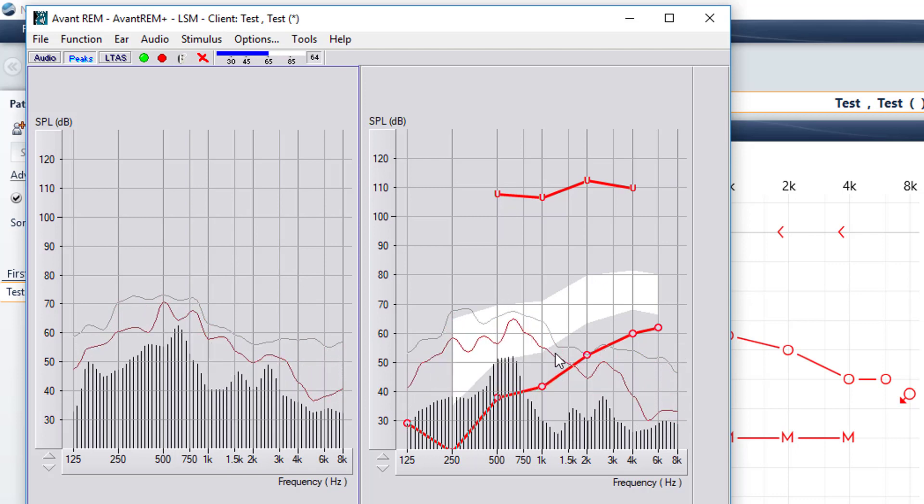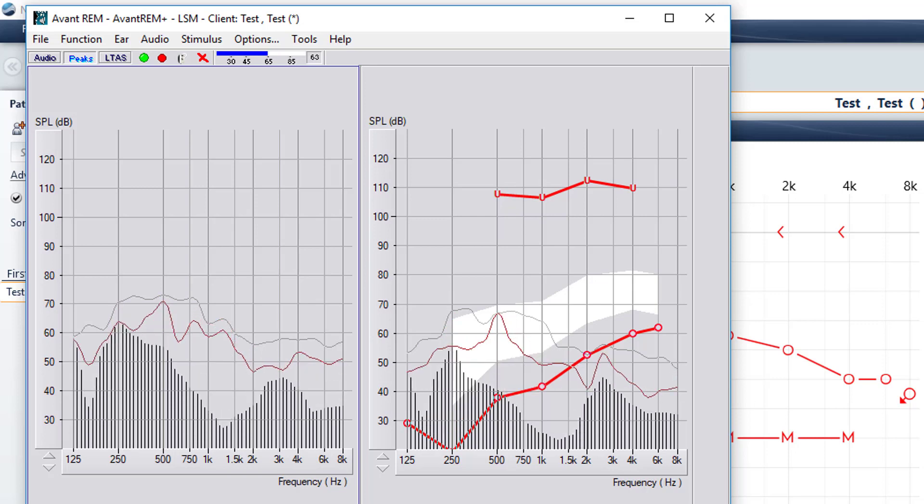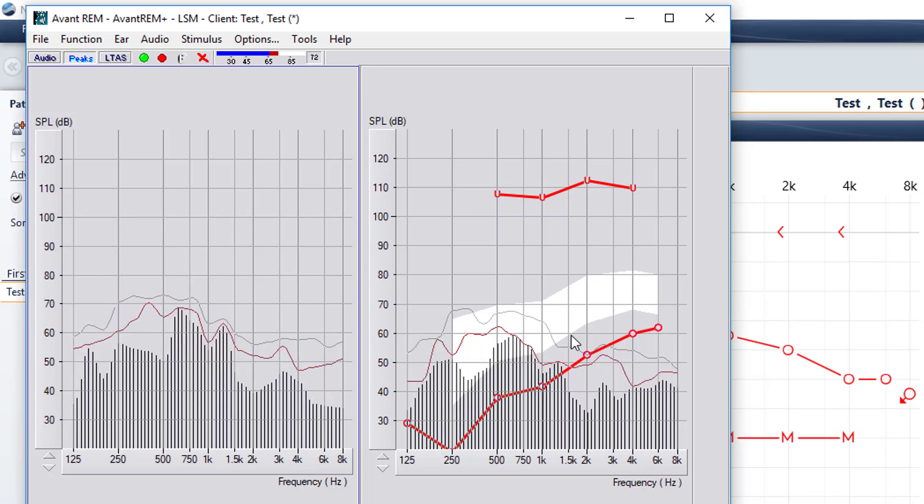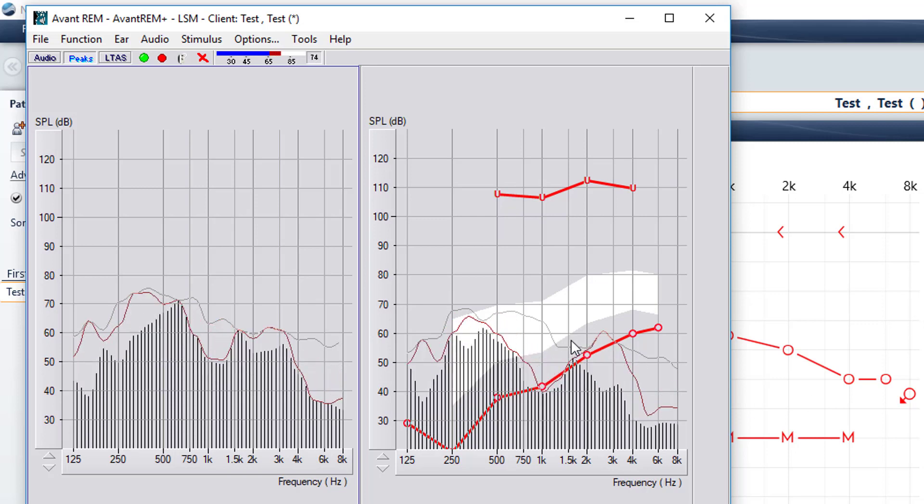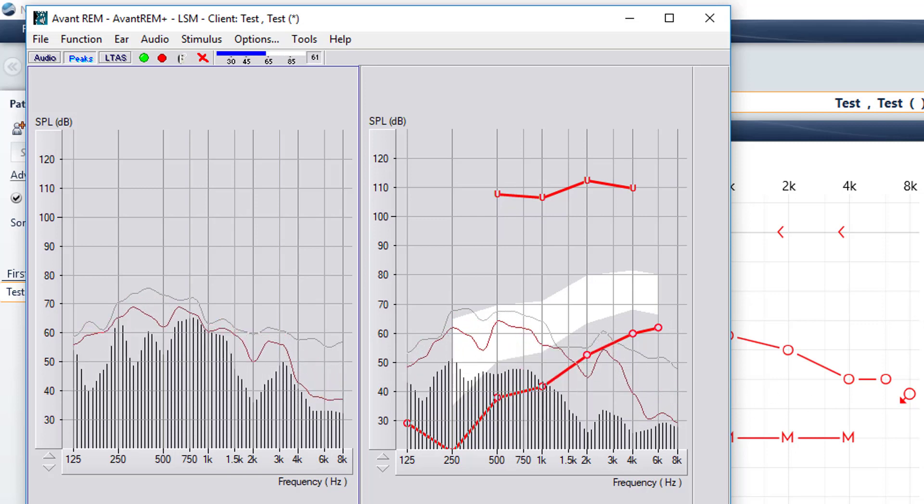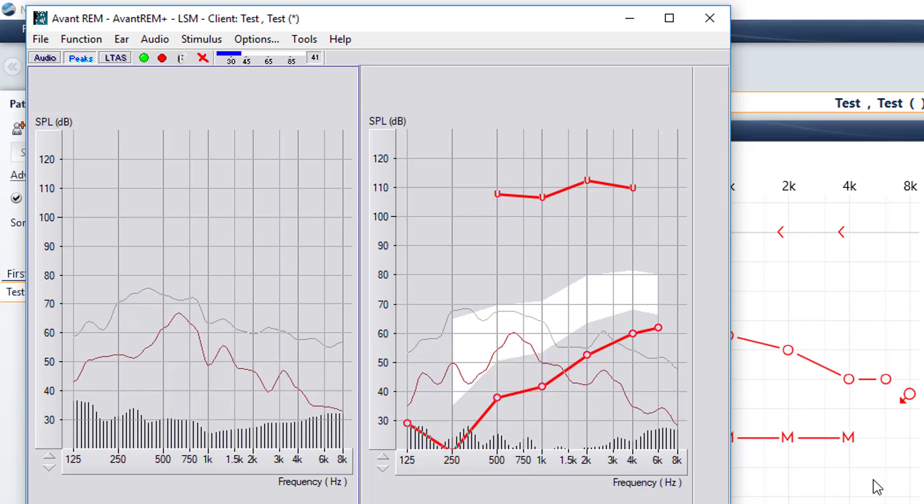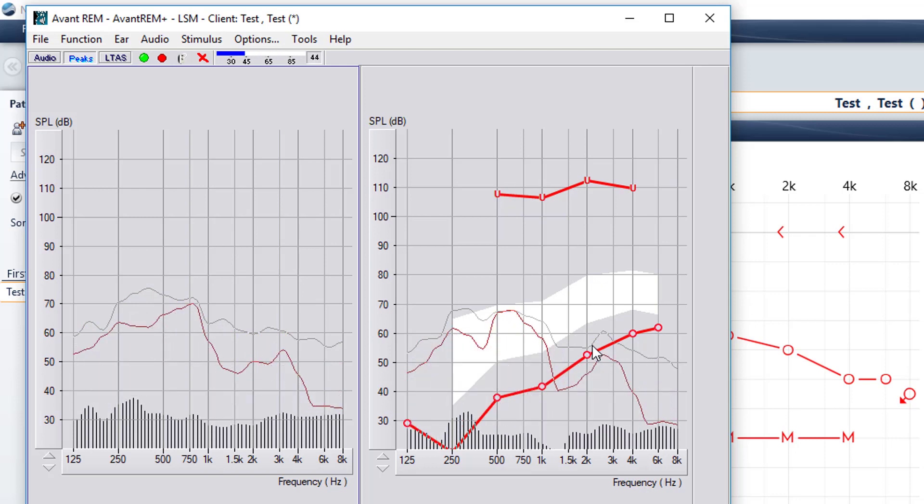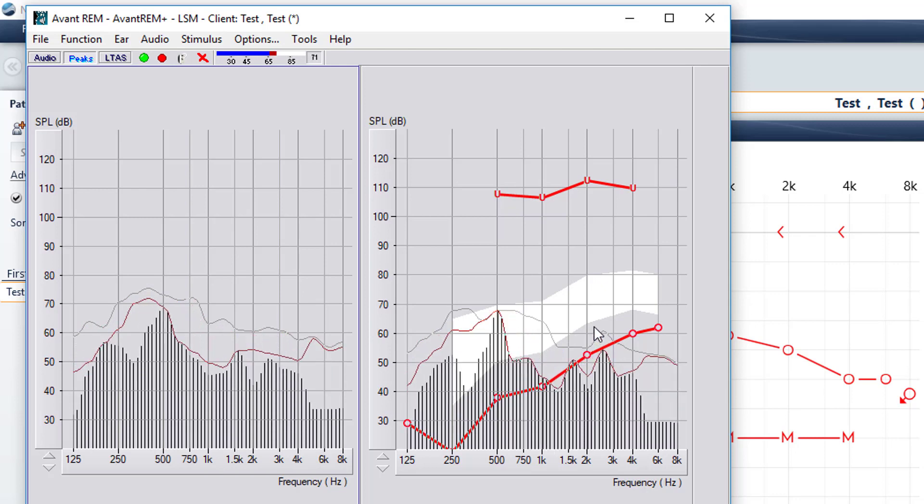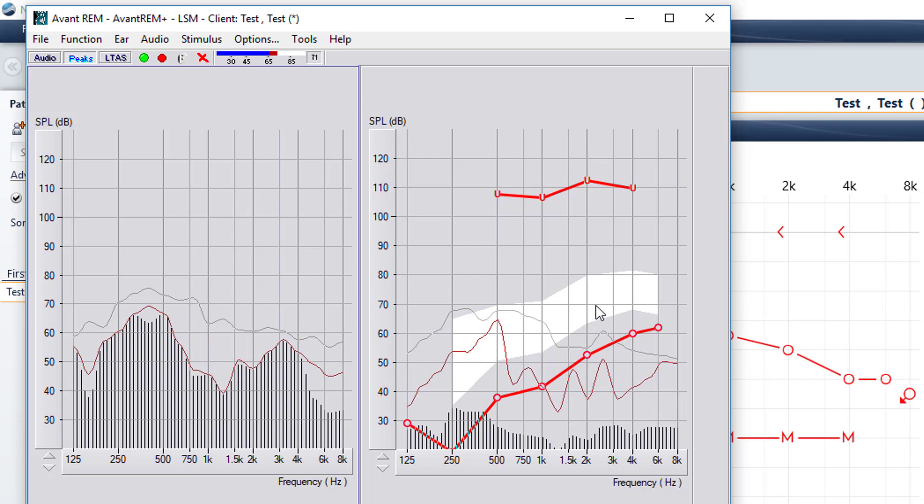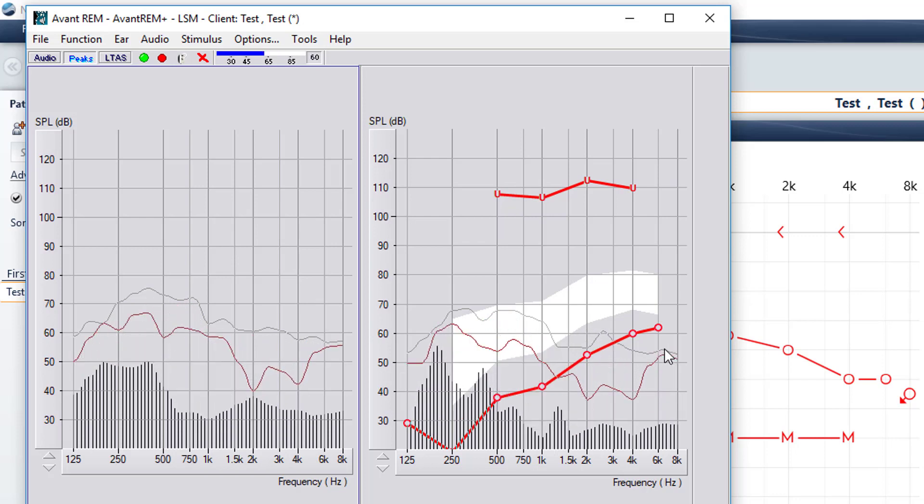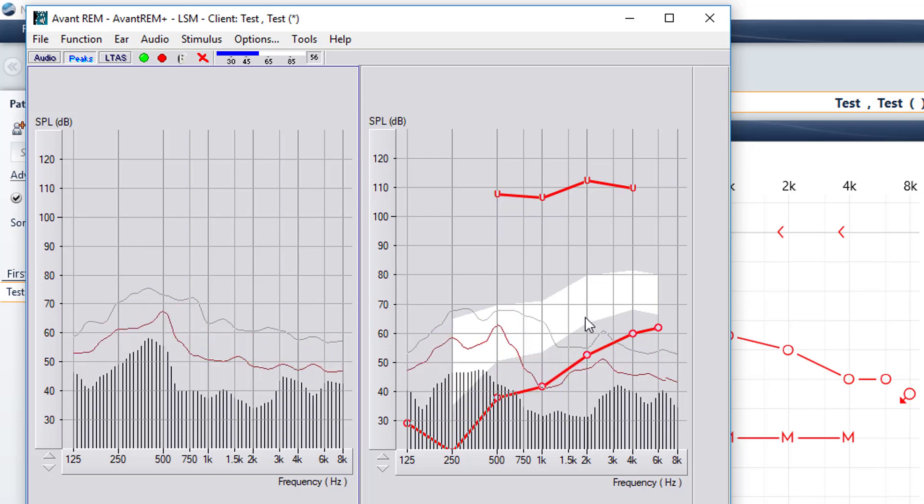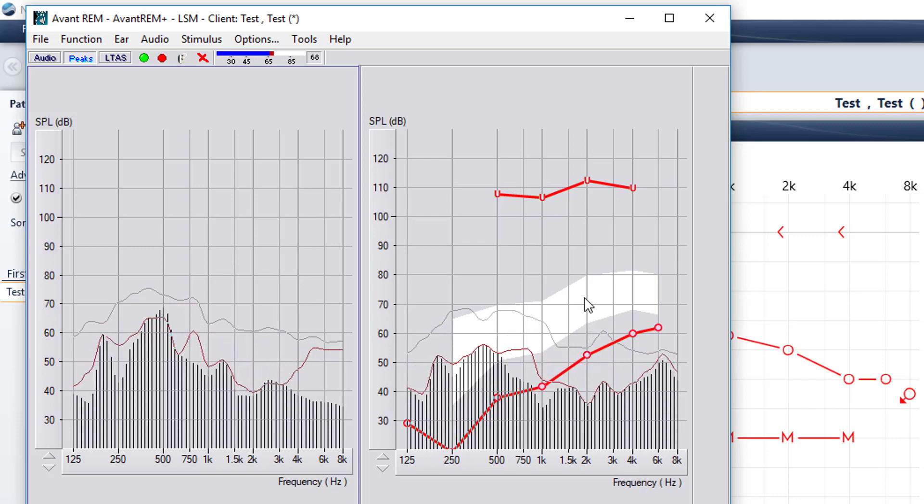So we can go into the fitting software looking at the right ear and grab 1500 out and start bringing up the volume. And what you'll see is this thin black line that's not moving is going to start to rise. And so as long as you go from low to high, you can use this feature.